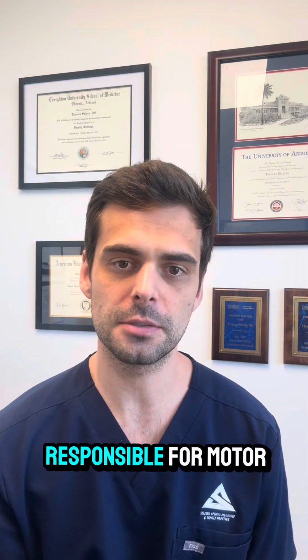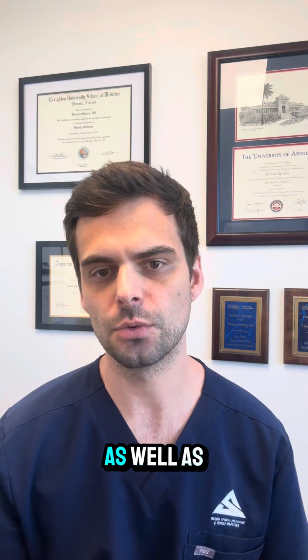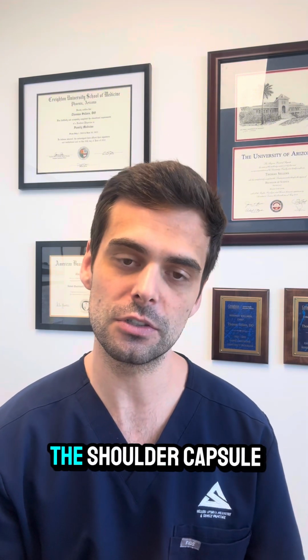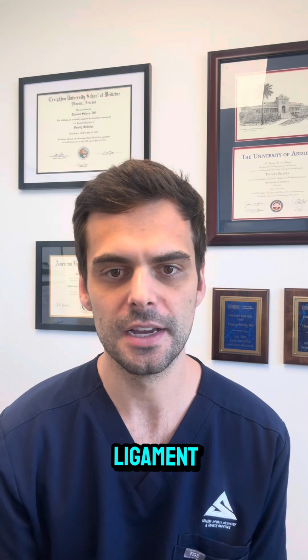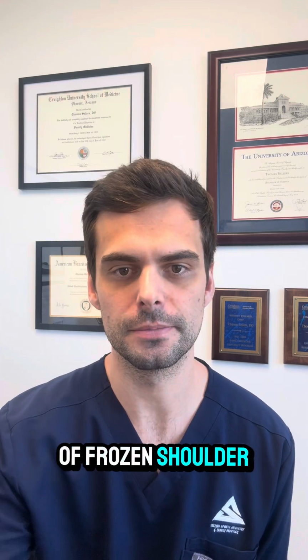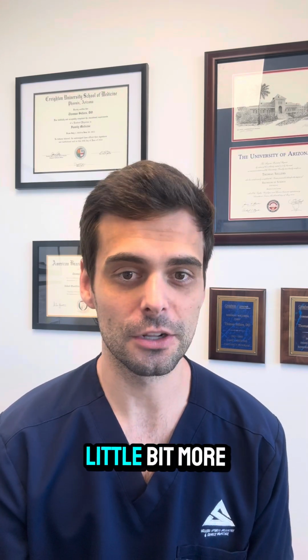This nerve is responsible for motor function to the supraspinatus and infraspinatus, as well as sensory function to these areas and sensory function to some of the shoulder capsule, as well as the coracohumeral ligament. And some of these are implicated in the pathophysiology of frozen shoulder. Let's review a video of the procedure and talk a little bit more about it.